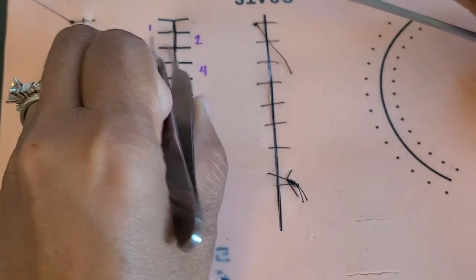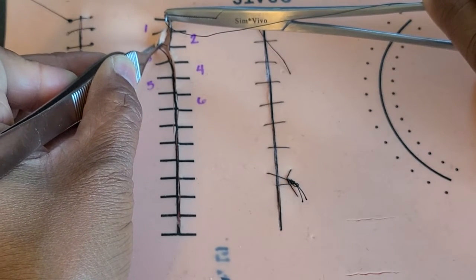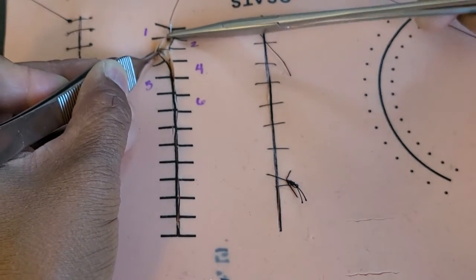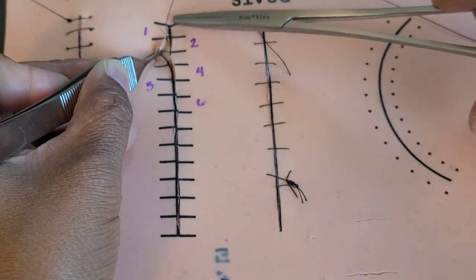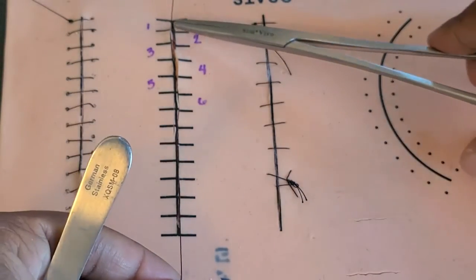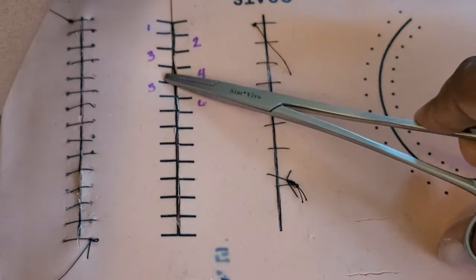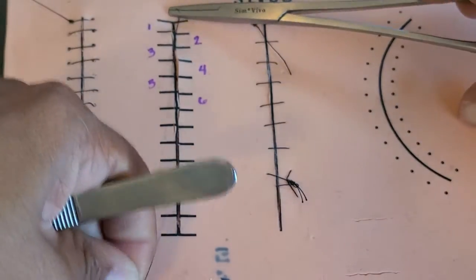Your first step is going to be somewhere along the edge: you take the dermis and subcutaneous tissue, and you take your needle in where the apex of the incision is, apex meaning tip, and you go along this incision line, tying your knot per usual, so double surgeon's knot, and then your simple square knot.